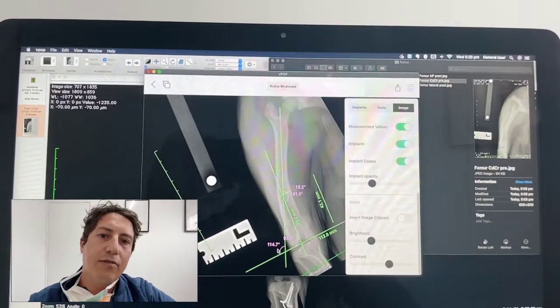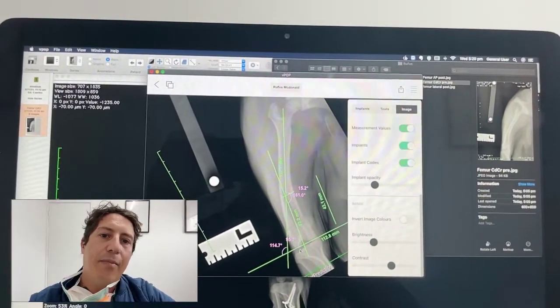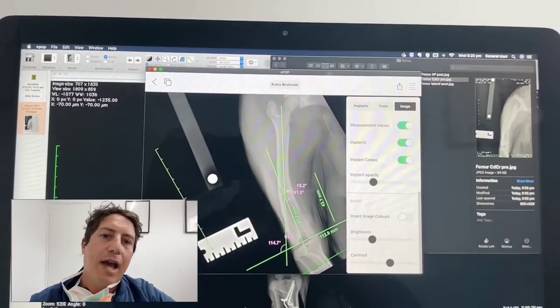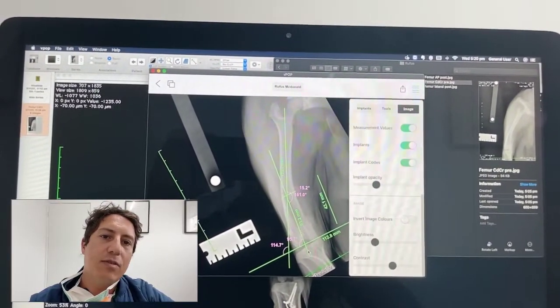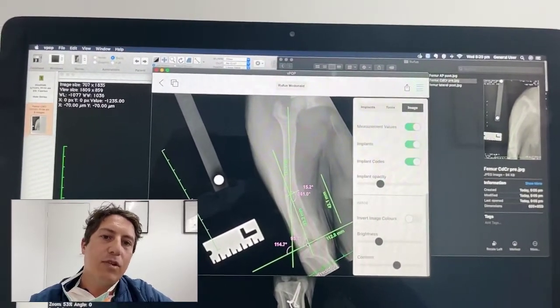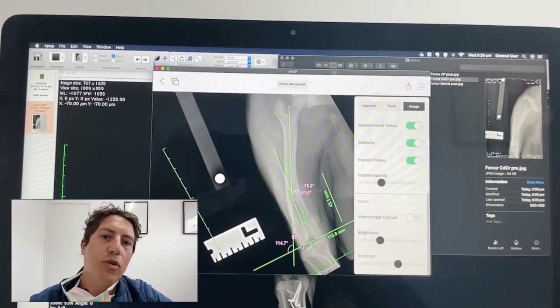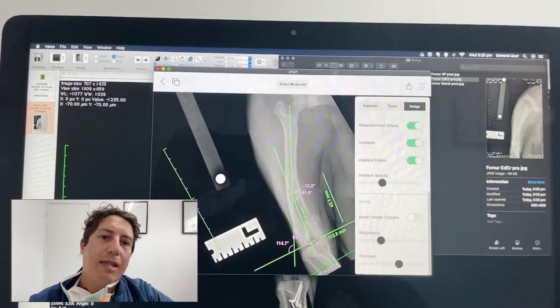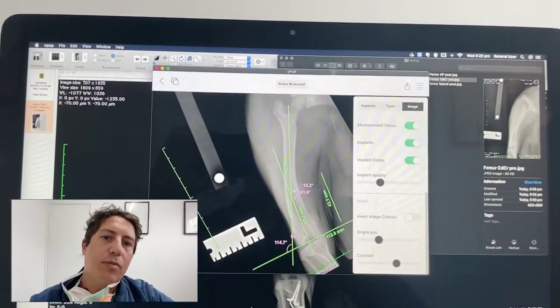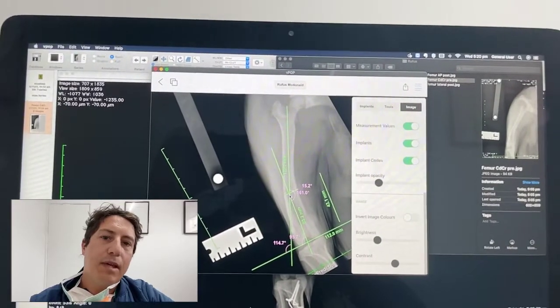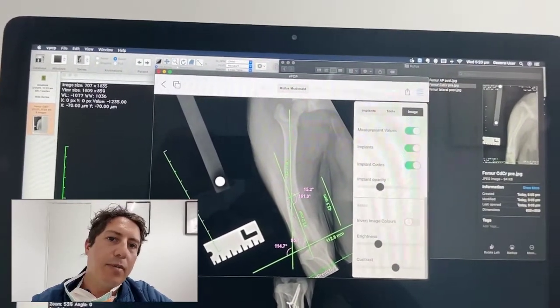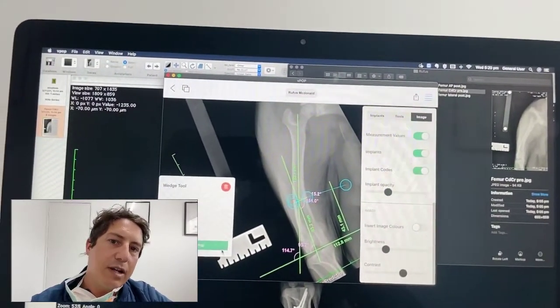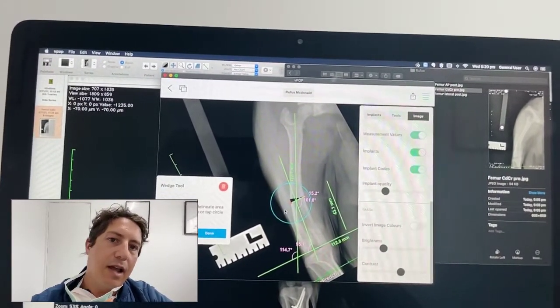We've also then put another line adjacent to the joint reference line, which has an angle of about 95 degrees — that's the normal anatomic lateral femoral angle. Based on those two measurements, we can work out where the CORA is up here, and using this really cool device from VPOP it's got a wedge cutting tool.